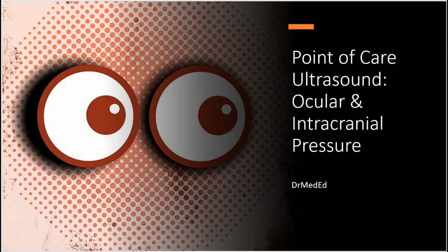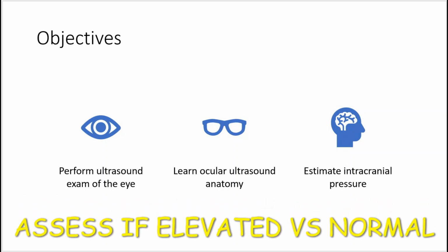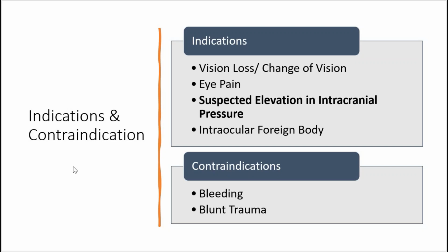Today we'll talk about point-of-care ultrasound, ocular, and how to estimate intracranial pressure. We'll talk about how to perform an ultrasound exam of the eye. We'll learn the ocular ultrasound anatomy and using the ultrasound to estimate intracranial pressure. Indications for using ocular ultrasound.